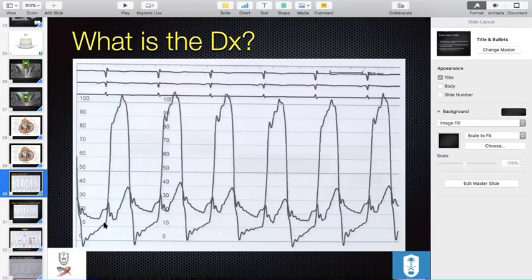You see here, you go to diastole. So here you can see it's upslope, upslope, upslope. So this is not atrial for sure. So it's either ventricular or arterial. Let's look at the peaks. How many peaks for each QRS? It's only 1 peak. Okay, that goes with ventricular now. Let's confirm it more. Is there an A wave? No, I don't see a clear A wave. There's a lot of wiggle, but I can't say there's an A wave. Okay, so that's not helpful.